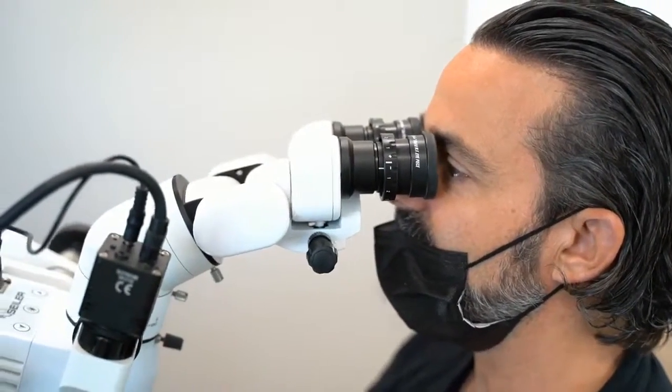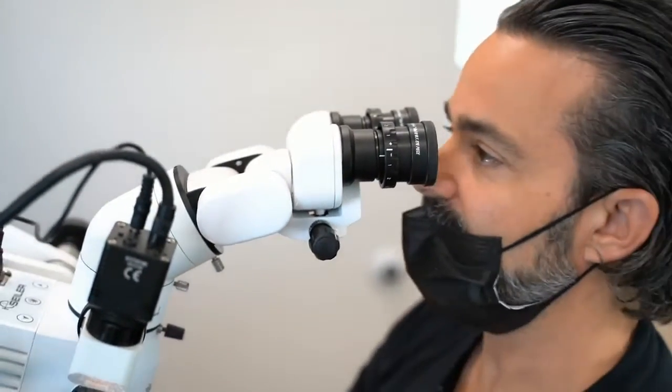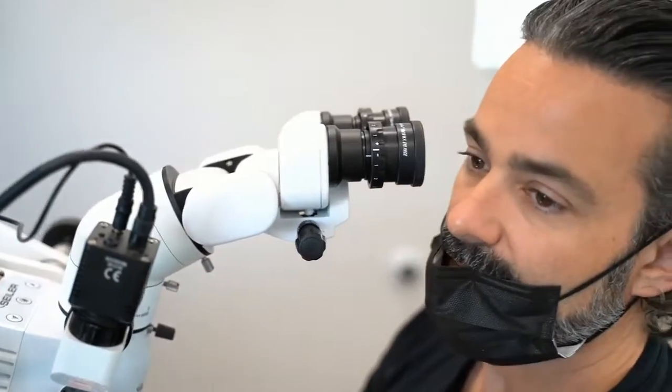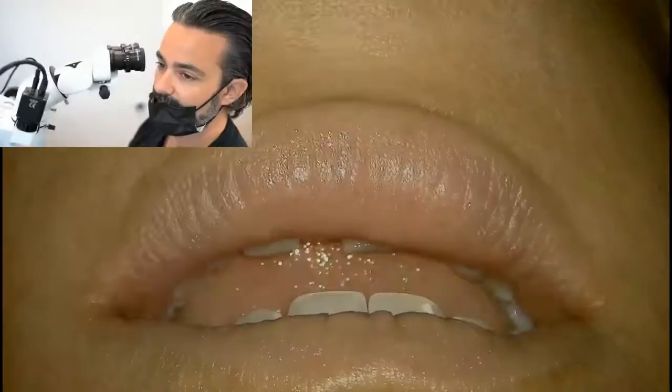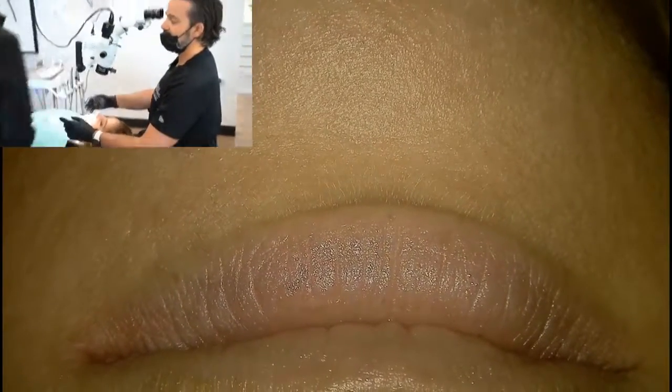If I come back to my patient, if you want to get it on both feeds, Mike, if you want to go out and look at the whole environment, go out to a corner. Sure.